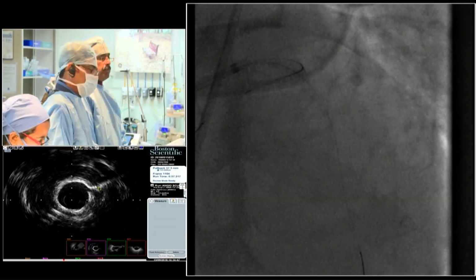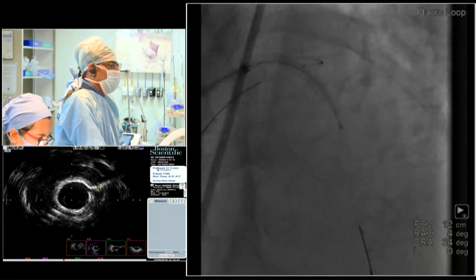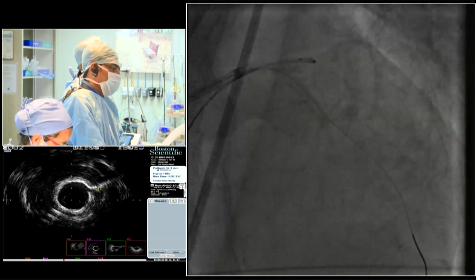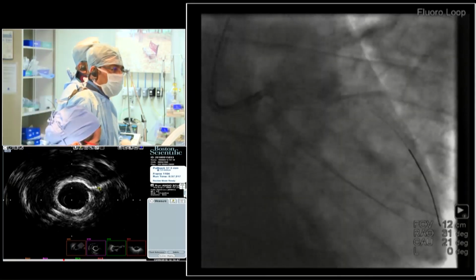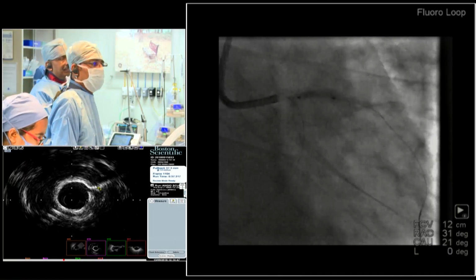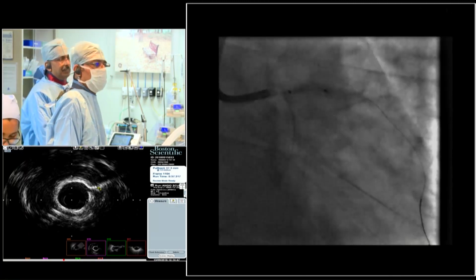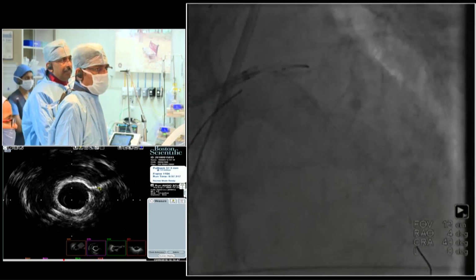Dr. Vijay, can you run that last picture again? This is Bhupati speaking. The particular picture you are showing in the IVUS shows near 360-degree calcification. Why don't we take a bigger balloon and dilate, even a regular NC balloon, before going for the stent? We have dilated with the 2.5 balloon, but this shows near 355-degree calcium except for the small cracked portion. What if the stent is not going to expand?